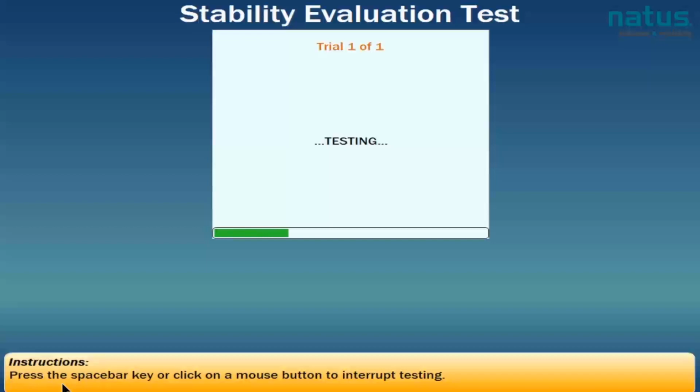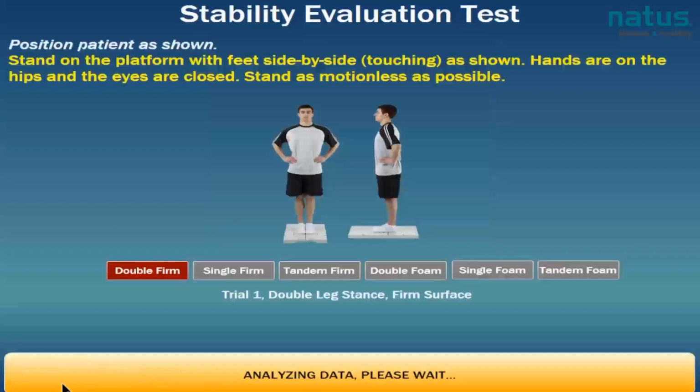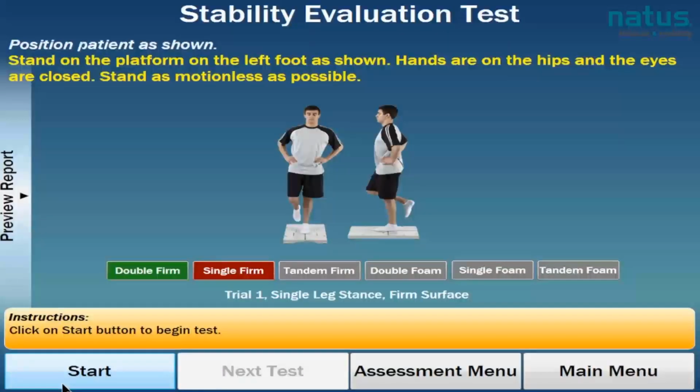I need to be sure that my patient is safe and that he understands his job is to stand as still as he possibly can. The computer will let me know how far along we are in that 20 seconds. We're almost done. All done, open your eyes. Great, perfect. You can relax now. We can let our patient relax between trials.